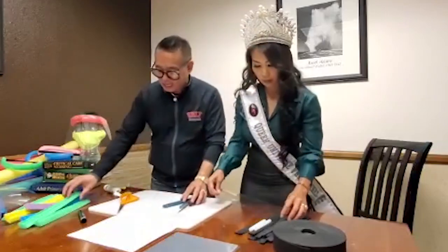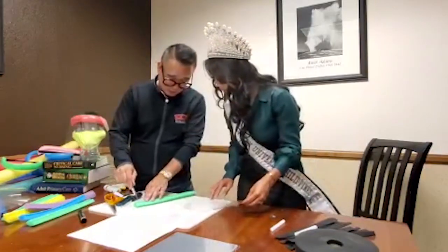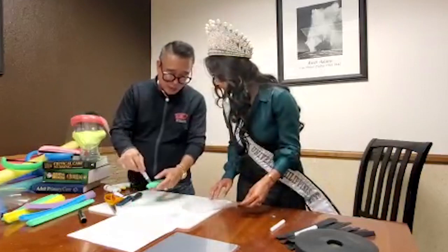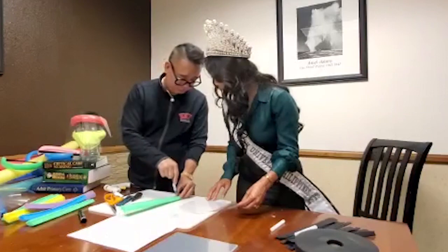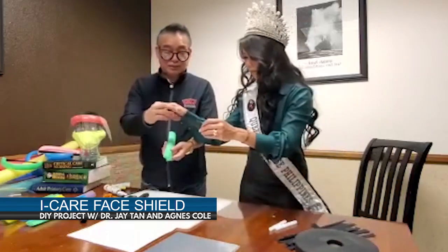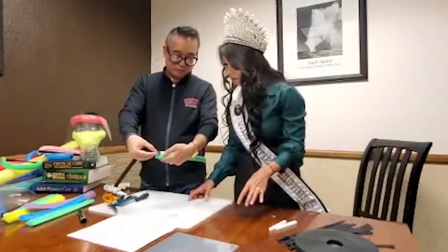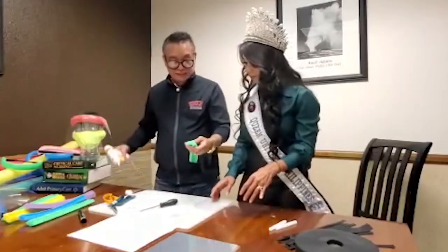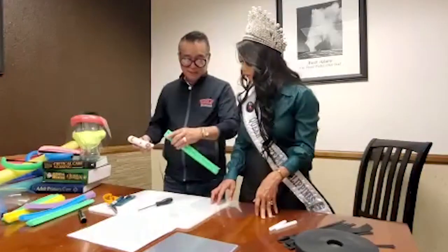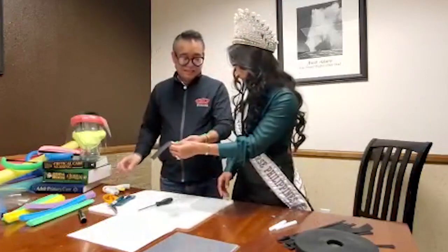Oh, wow. Okay. And now we have this, and I'll use this one of the 1/4. It's so easy now because you just have to make a little hole about 1/2 inch from the edge using your cutter. Can you please hand me the garter, the smaller one? So now you need the garter or elastic band. All you got to do is put it here to the edge where you made a hole. Push using your screwdriver there, and then to make it more sturdy that's when you need this glue gun here, then you fold. Make sure you glue gun also the opposite side. Perfect. Now it sticks.